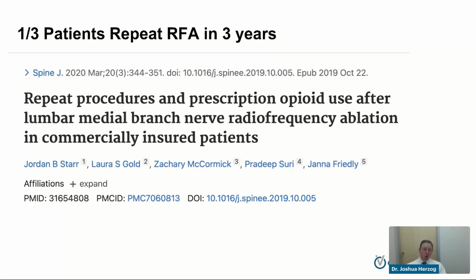The other thing that endoscopic spine can do is help with some of these back pain problems. Classically, for back pain that's mediated or generated by the facets, we've done some blocks to the nerves that innervate those, and then we'll go in there and burn those nerves. That sometimes doesn't last for a long time. So the beauty of endoscopic spine is we can go in there and actually cut or remove that nerve that generates the pain to the facet joints on the back. And then it's a more long-lasting and more complete relief of that back pain. We're going to talk about that in the examples.